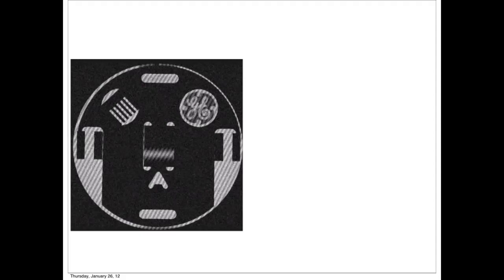All right, so this is an MR image that I collected. If you're familiar with this, you'd see that there is something wrong going on with this image. Does anybody have an idea what's wrong with this image? Somebody can say, oh, it has the G logo and not Siemens, but that's not what's wrong with it. Is it the ripple in all the white areas? Yeah, there's this periodic signal on top of it. Any idea where the source is? This is an image I actually collected. A spike?